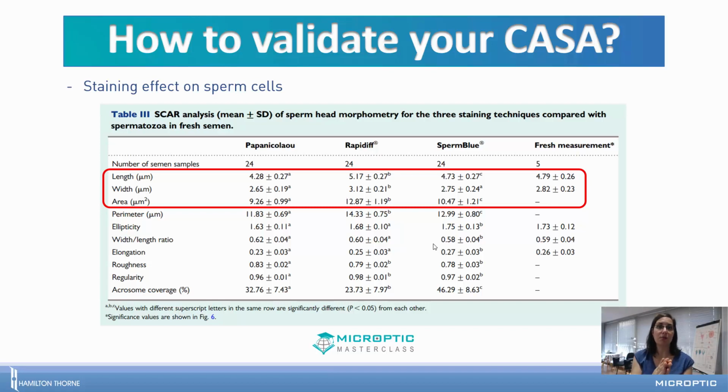So it's important to take into account, when first deciding what solution you want to incorporate in your routine, what the possible effects on your sample are, and to keep that in mind for the diagnostic, for doing a good interpretation of the results.